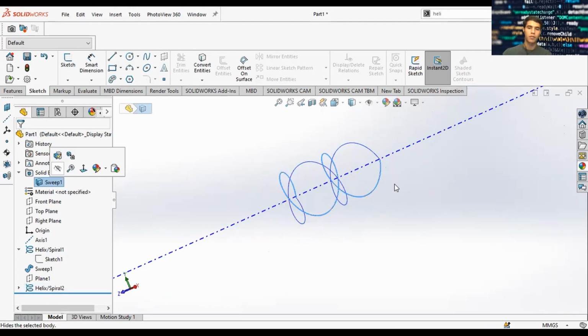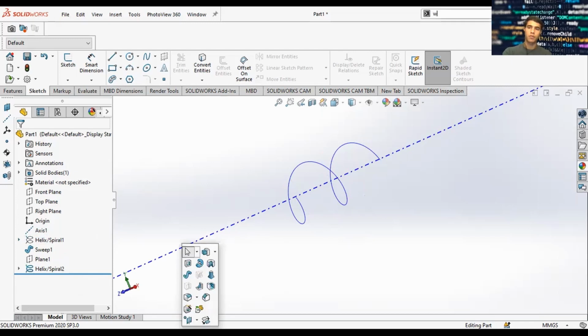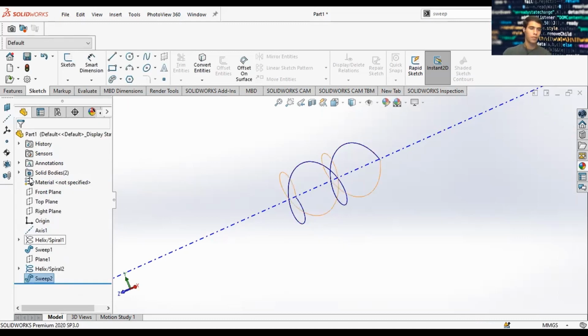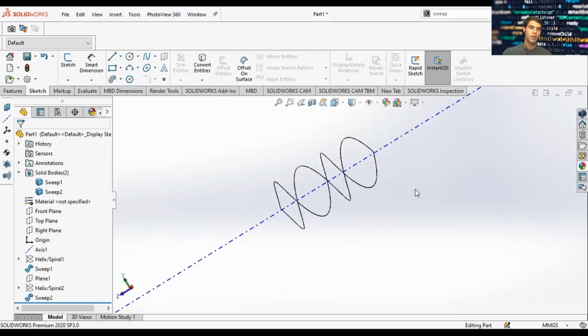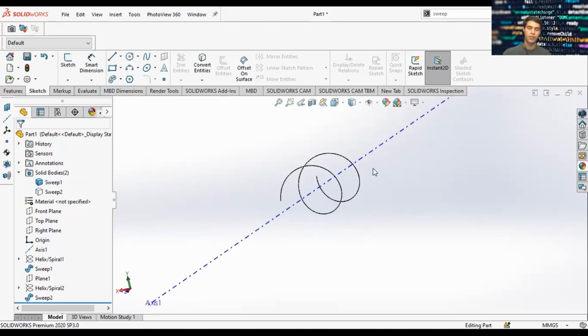Let's hide this solid body. And let's also hide this first helix spiral. So we can have our second helix and work on that. So we're going to repeat the sweep function. Sweep. It's going to give us that profile we want. Now, we have two solid bodies, and then we'll bring them both back. We'll hide this sweep. There's our solid bodies. So what's next? We have our axis, and then we have our strands. We're going to revolve and rotate these strands. And it's going to be a rinse and repeat from there.